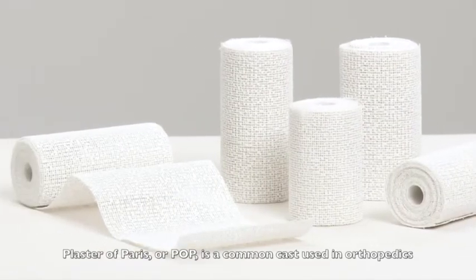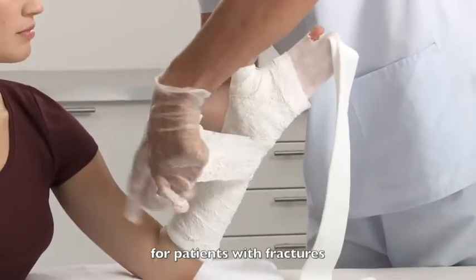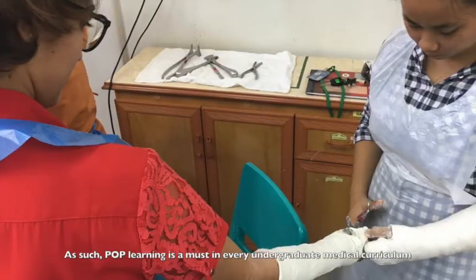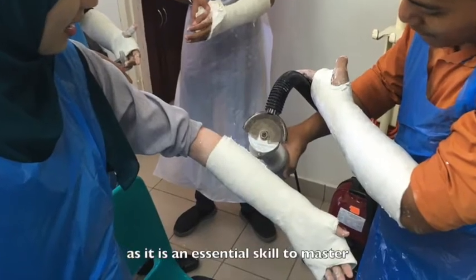Plaster of Paris, or POP, is a common cast used in orthopedics for patients with fractures. As such, POP learning is a must in every undergraduate medical curriculum as it is an essential skill to master.